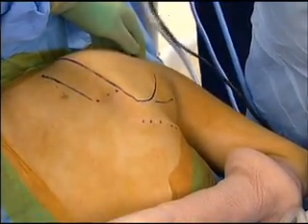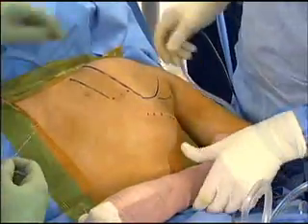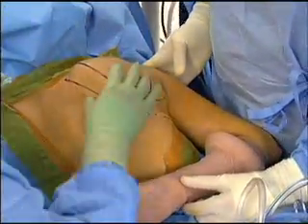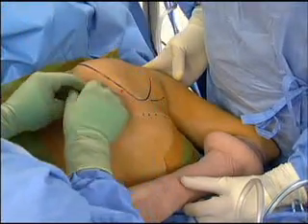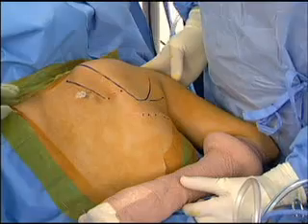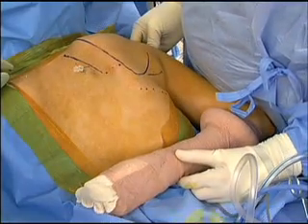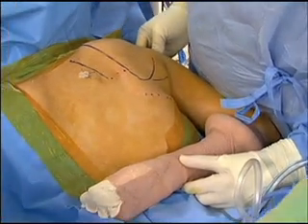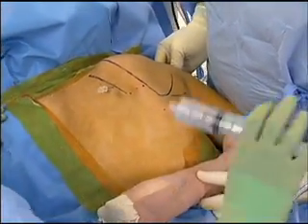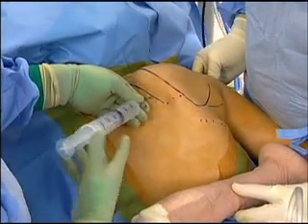Once general anesthesia has been administered, the patient is placed in a prone position. The extremity is draped in the usual sterile fashion. The scapular margins, as well as the orientation of the nerves about the scapula, are marked out using a sterile marking pen. In this patient, the scars from her previous surgeries are dotted with a marking pen. The affected extremity is then placed in an extended and internally rotated position to wing the medial border of the scapula, also known as the chicken wing position.